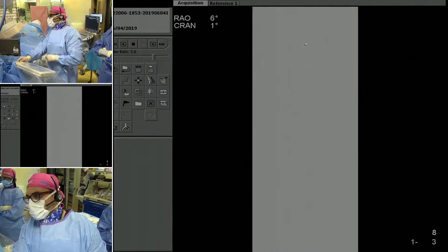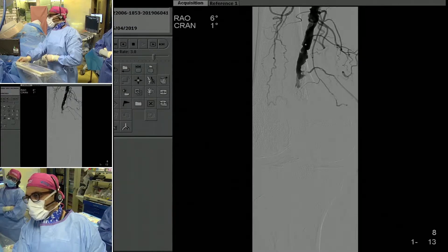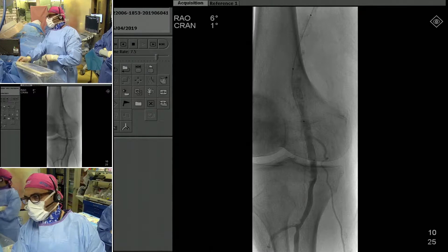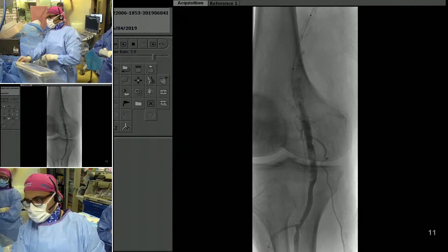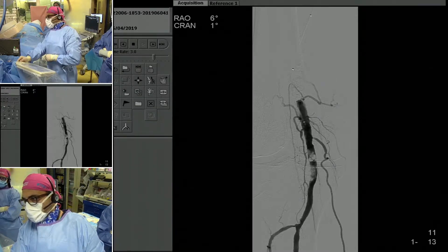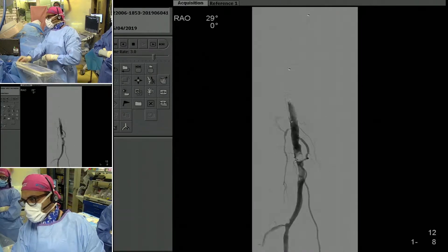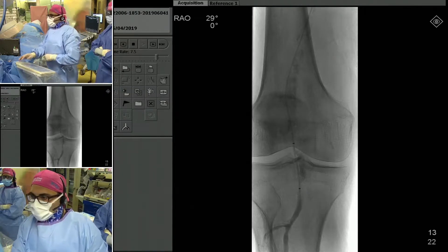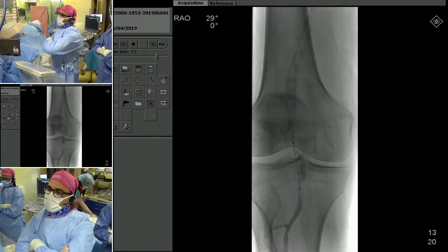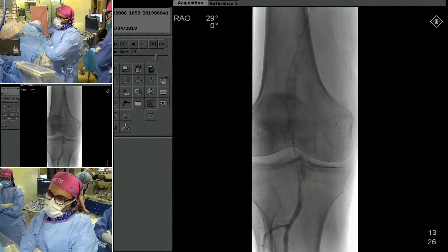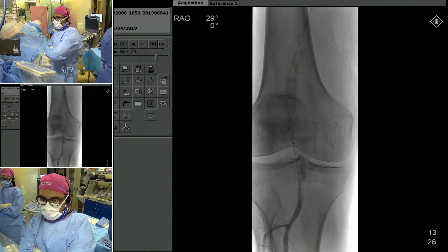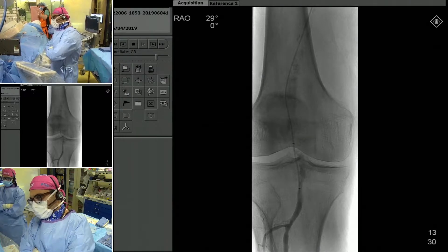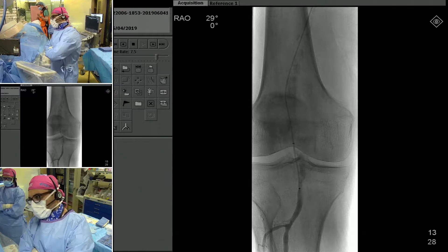We got down to the level of the first lesion with a 0.035 Quick Cross catheter and a glide wire. We crossed that first lesion and managed to stay intraluminal. We then worked on crossing the second lesion, and now we're across both lesions. So I'd put this out to the crowd — at this stage, what would people do? Would people attempt to do orbital atherectomy with CSI?